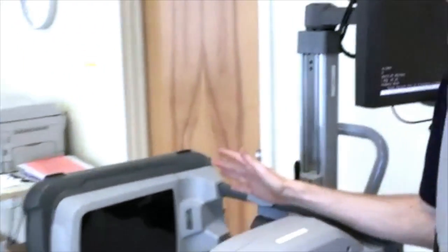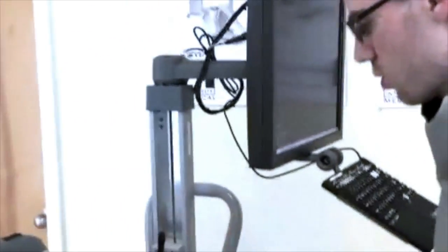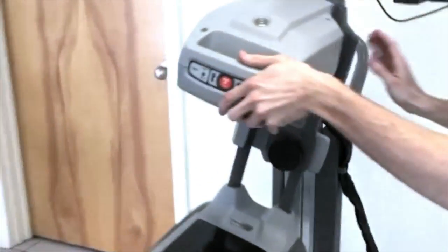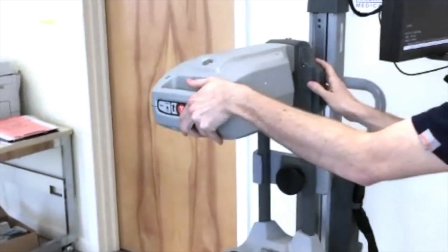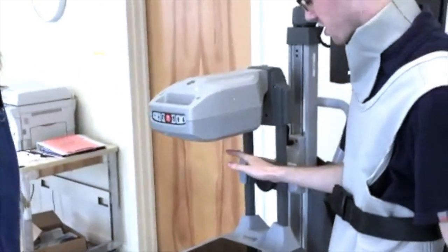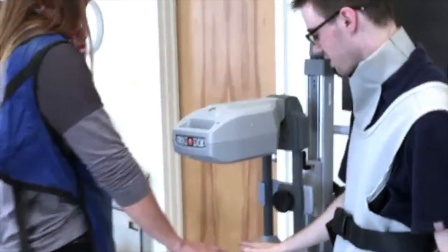Then you can have the C-Arm like this, or you can move it upwards like so, and then you take the patient's hand and put it right here.